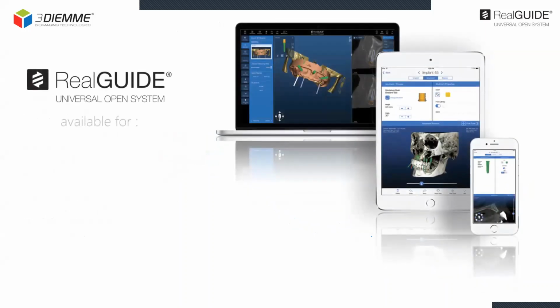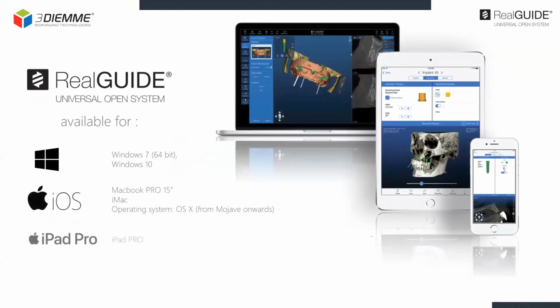RealGUIDE is available for Windows devices, starting from the Windows 7 operating system onwards, for MacBook Pro and iMac from the Mojave operating system onwards, and also for iOS mobile devices, iPad Pro and iPhone 7 Plus onwards. It's currently not available for Android devices, as, unlike iOS devices, they are not yet certified as medical devices for diagnosis.